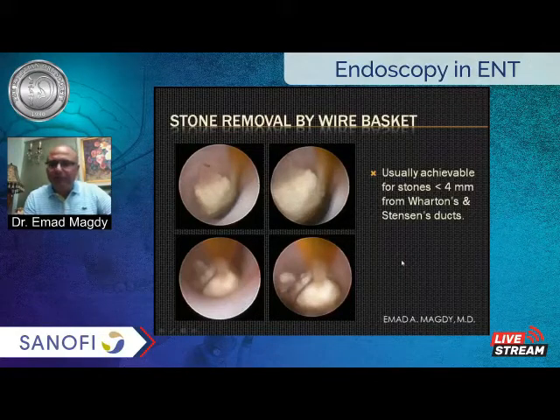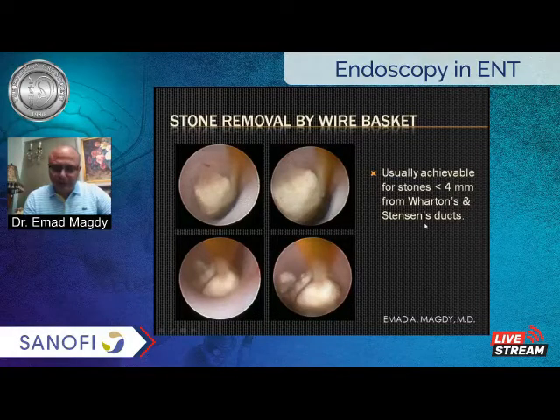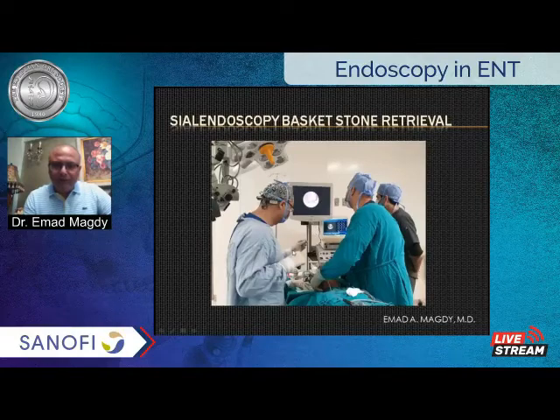And this can usually be achieved for stones that are less than 4 millimeter from the Wharton's or the Stensen's duct. When you're doing that, you have to have a knowledgeable assistant, because one holds the scope and the other one is actually manipulating the basket. And I'm very lucky to have, over the years, developed a very good team here in Alexandria that is very interested in the technique, and without them, I can't work in this very delicate kind of surgery.